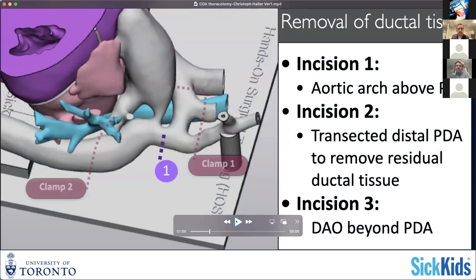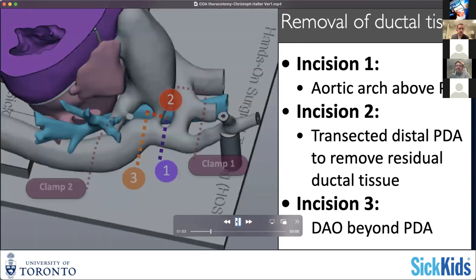Once that's clamped, the clock is against you. The length of your cross-clamp time is basically what determines the length of ischemia of the spinal cord, or potential ischemia of the spinal cord. While it's usually tolerated quite well for the time that even a more complex repair would take, you don't want particularly long cross-clamp times with the risk of spinal cord injury. It's fairly rare, but it's certainly been reported.